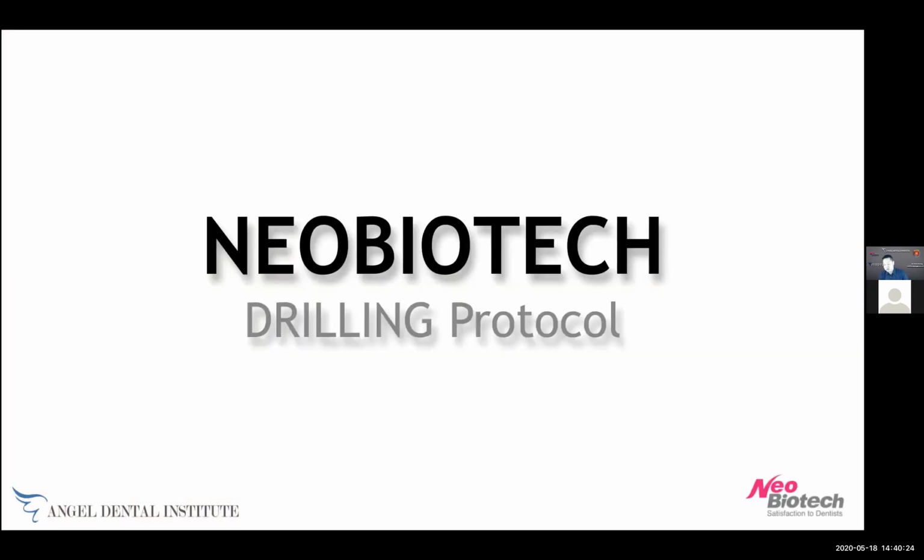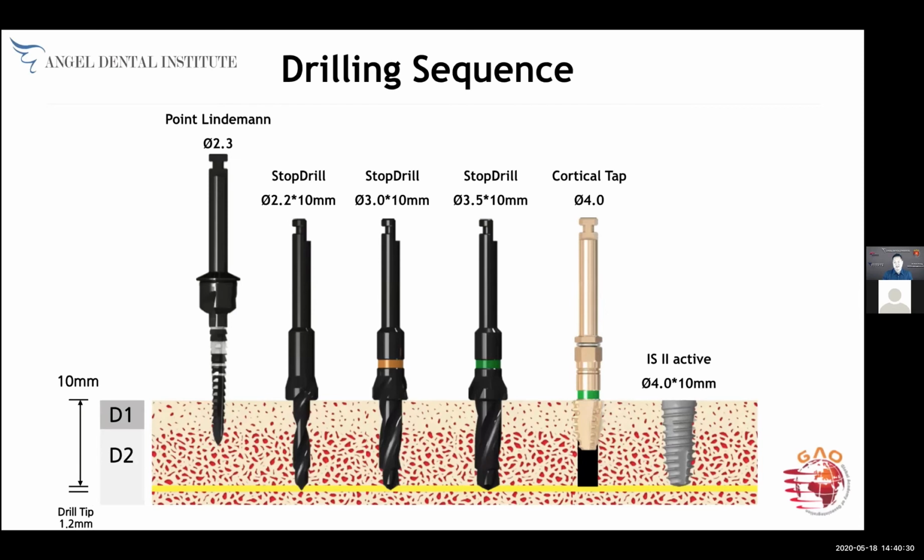So drilling protocol, okay? Drilling protocol for Neobiotech implant. Here, we're gonna go through a drilling sequence. This is a typical one. If you look at the bottom left here, D1, D2, that's the bone quality of the bone we're working on.